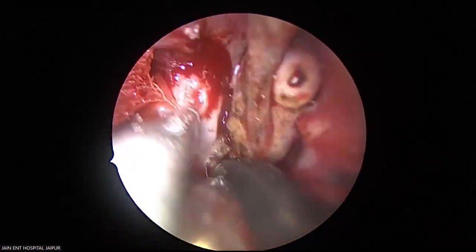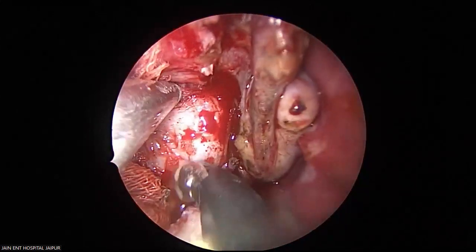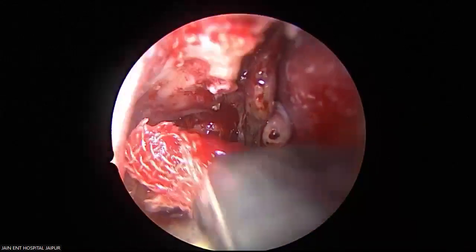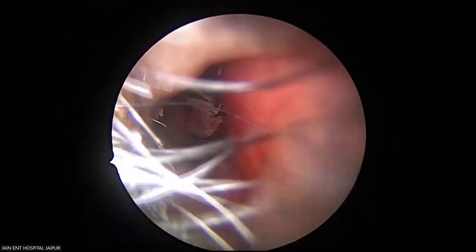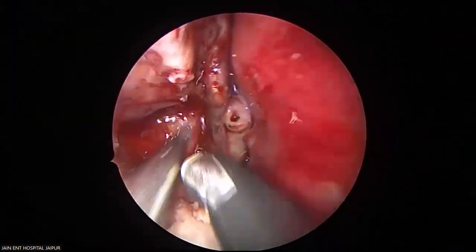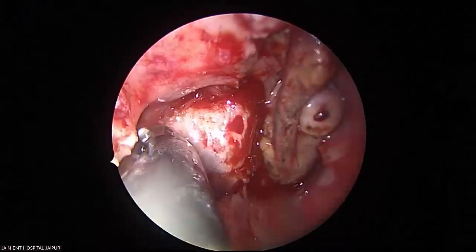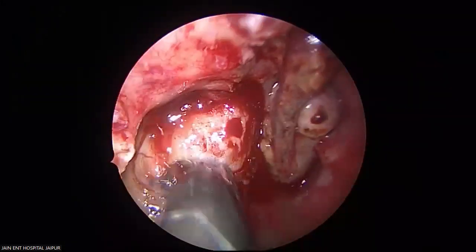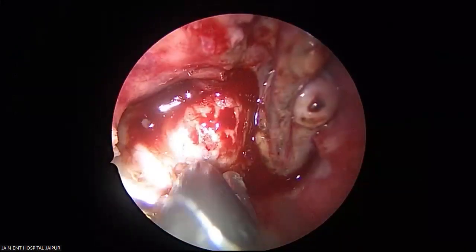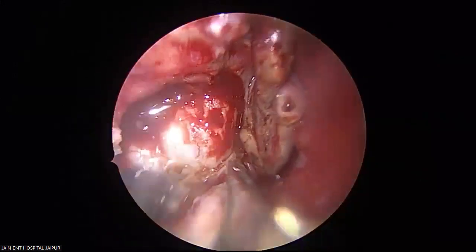This is all posterior wall of the maxilla. Now what I am doing, removing this mucosa. Wash. Removing this mucosa from the posterior wall. See this very clear? Exposing the posterior wall of the maxilla thoroughly.